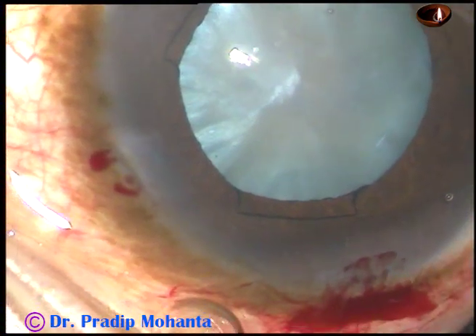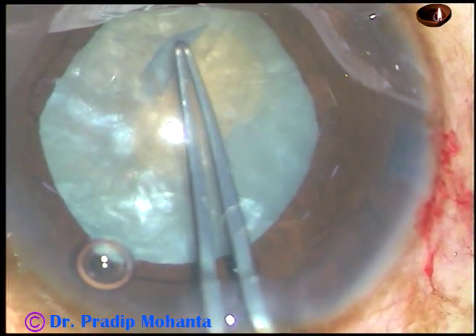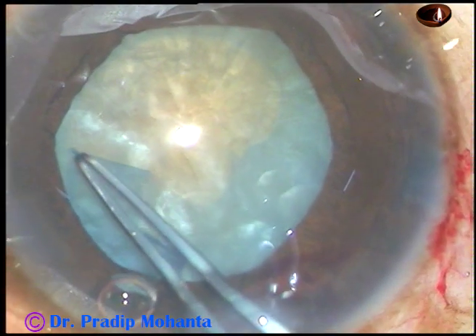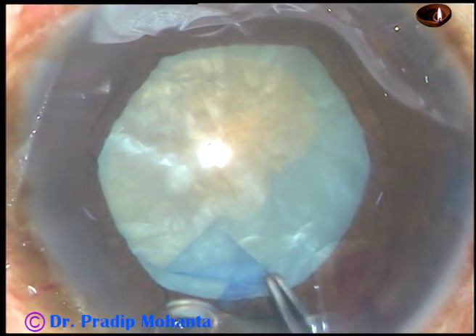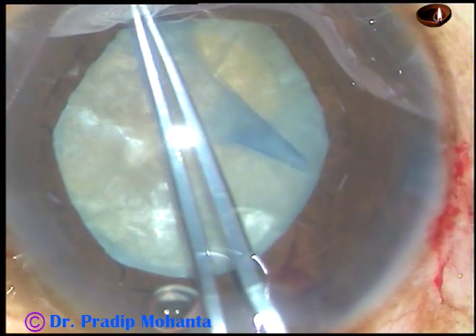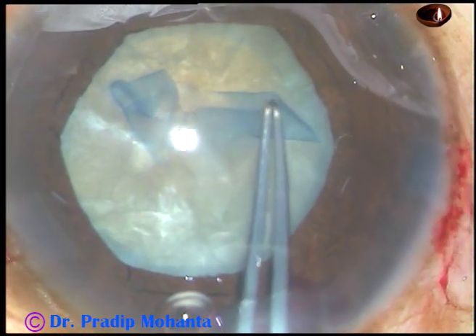And now the pupil will not come down. Capsulorhexis has been done in two stages: first a small rhexis, some cortical matter was aspirated, and then this adequate-sized rhexis is done.